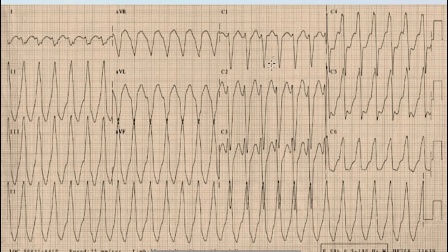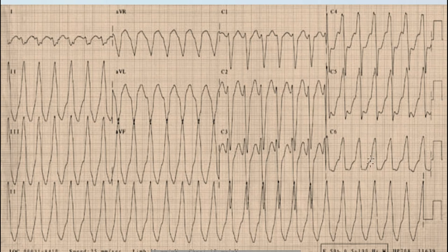Here we can see that the QRS complex is predominantly negative in the first three leads, whereas it is positive in leads V4, V5, and V6. So concordance is absent in this case.